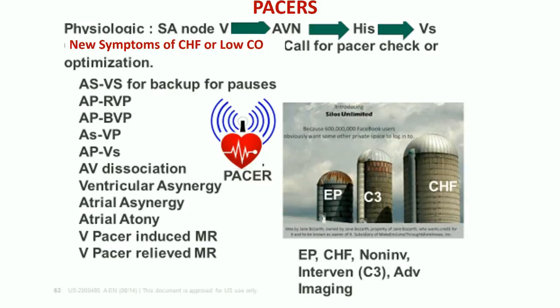And so we've got atrial pacing, biventricular pacing. Well, that's getting closer to being physiologic. But in terms of biventricular pacing, again, we've got an RV pacer at the apex, and that's not where the RV normally depolarizes. It depolarizes at the septum. And then we've got a left ventricular pacer lead that's gone somewhere.